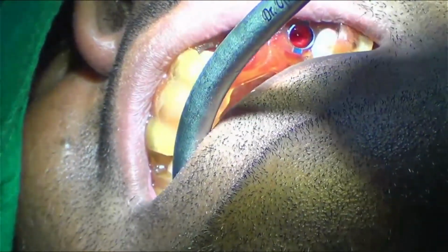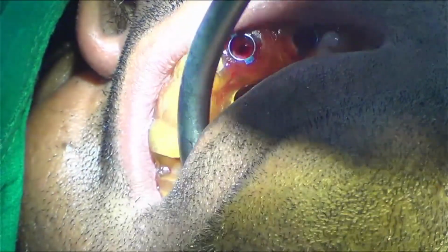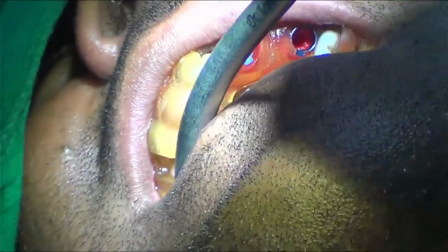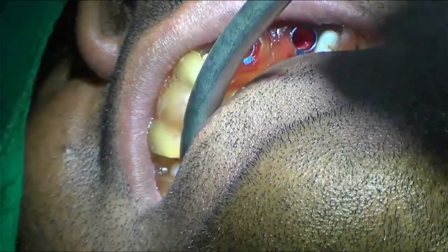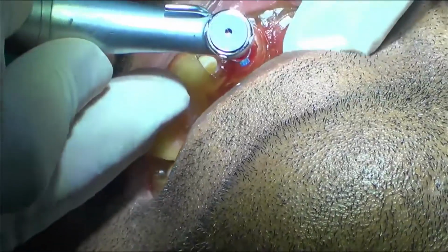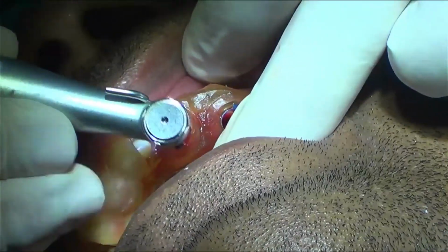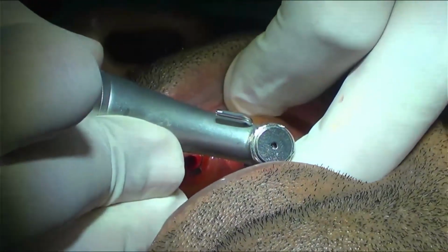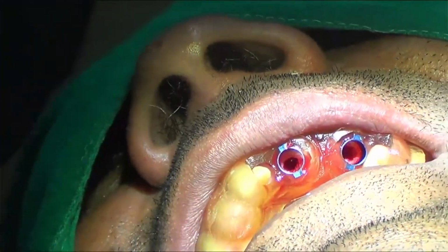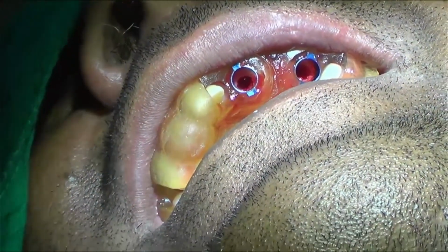So once my profiling is done, my next drill is 3.0 into 8.5, as I am putting a 3.8 implant. Remove this. Then 3.0 into 11.5.